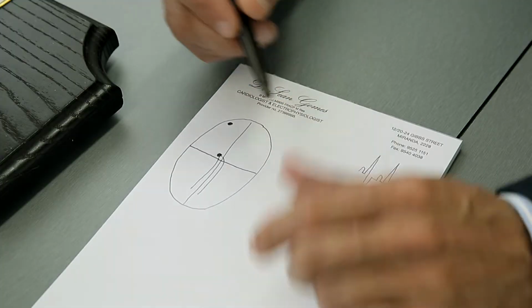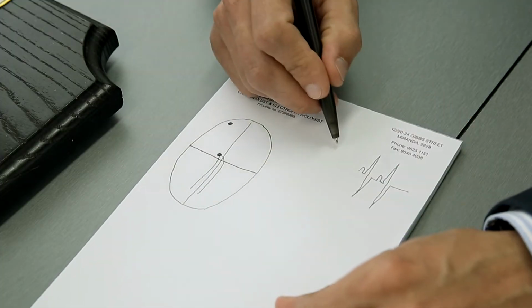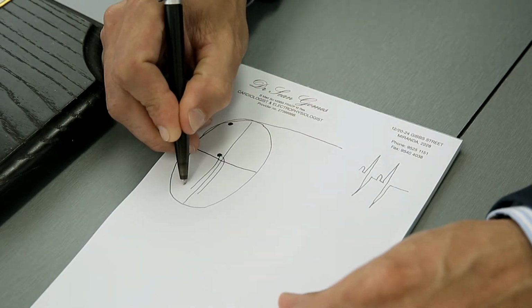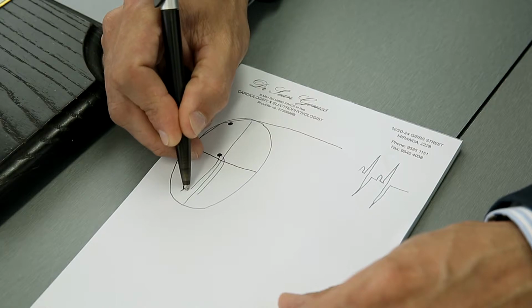The implantation procedure involves a general anaesthetic in most cases. After a patient is put to sleep with the general anaesthetic, a small incision is made under the collarbone in this region. Space is made for the defibrillator, which is called a pocket, and then wires are introduced into the vein under the collarbone. In most cases, there will be at least 1 wire which will attach to the bottom of the heart. That will be in all cases.